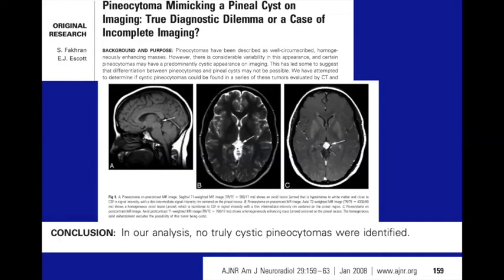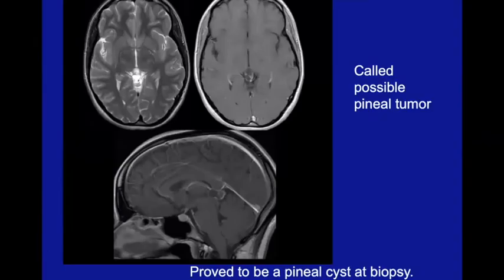And in their conclusion, and I like this also, they're pretty definitive. No truly cystic pineocytomas were identified. So all of the cases they had this property of nodular enhancement. So if you don't see nodular enhancement, don't be raising the question of a low-grade neoplasm.